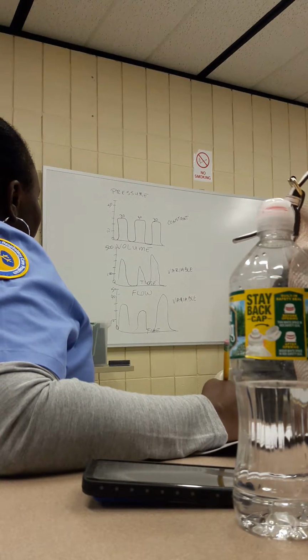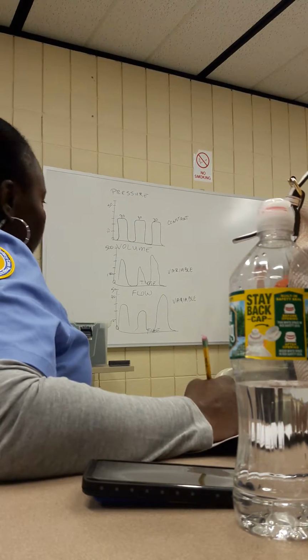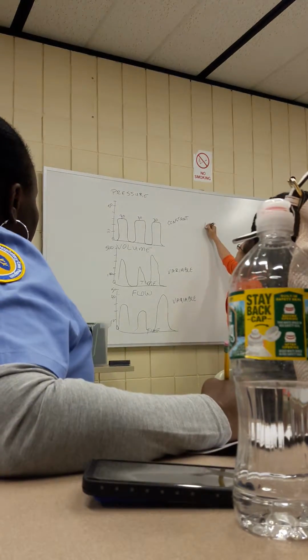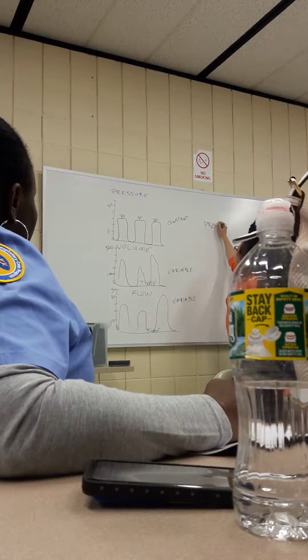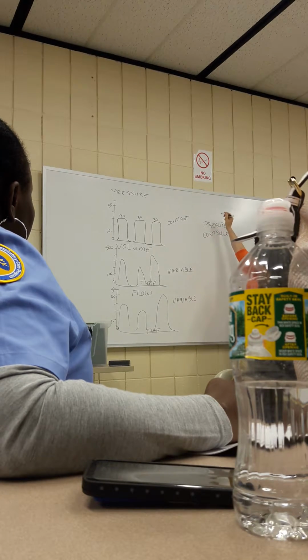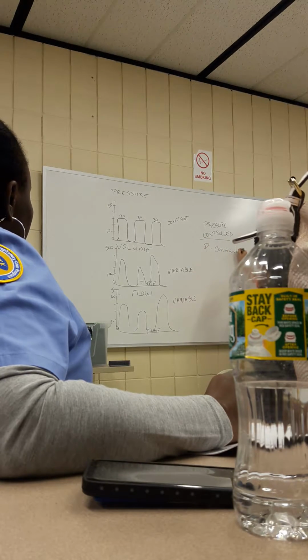So when I'm looking to find out what the control is, if it's pressure controlled, then this pressure is constant, so P is the pressure.